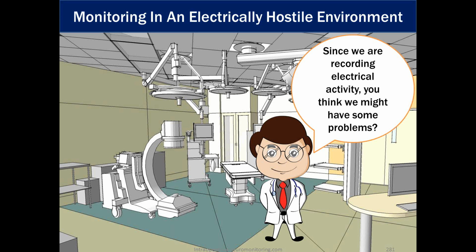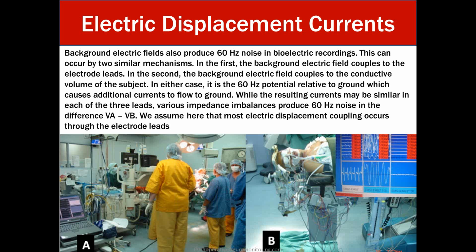So, monitoring in an electrically hostile environment. Since we're recording electric activity, you think we might have some problems with our recordings. So we're going to talk about how we battle every day to get rid of some of this electrical noise from the operating room.